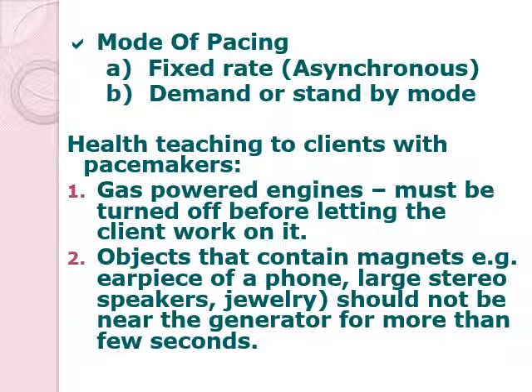Whereas your demand or standby mode would only fire electrical impulses whenever there are abnormalities detected on the P wave and then the QRS complex. So for example, if there is no P wave that was elicited, your demand or standby mode pacemaker will be able to release another electrical impulse to augment for the missing P wave.